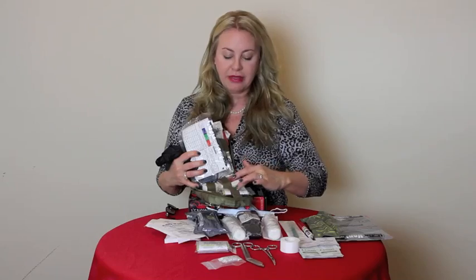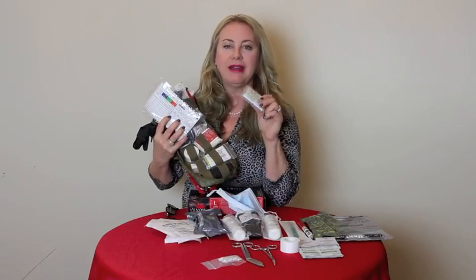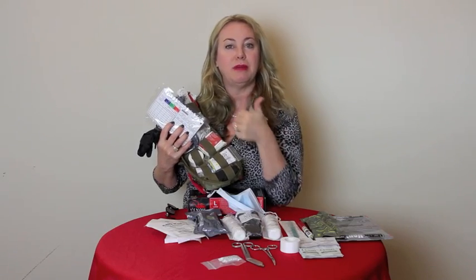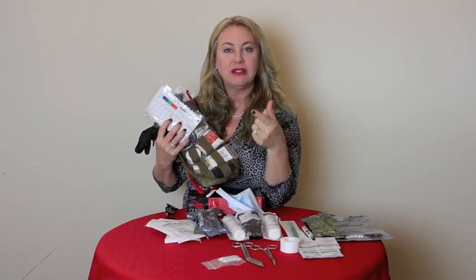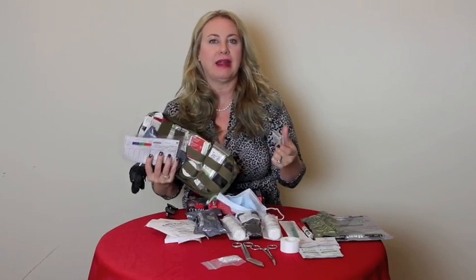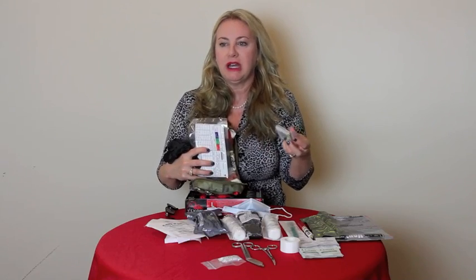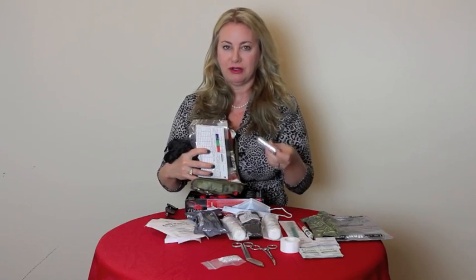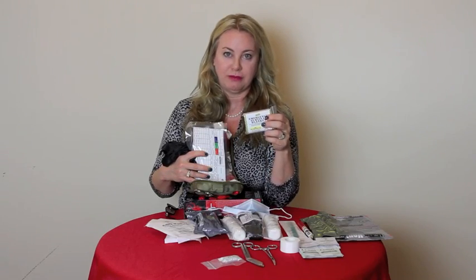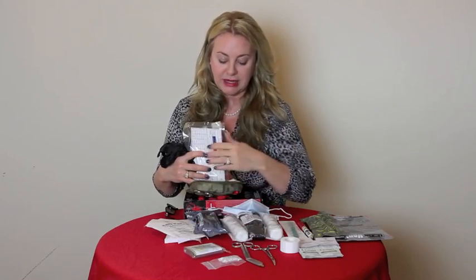Underneath the gloves in the second area is a Mylar blanket. Now, you might ask yourself, why a Mylar blanket? This is awesome to keep the patient warm and also to help prevent shock. Somebody who's losing blood or something traumatic has happened, they're going to go into shock. They're going to be disoriented. They're going to be confused. And this can help prevent that shock situation. So a Mylar blanket, I feel, is a very important part of this kit.